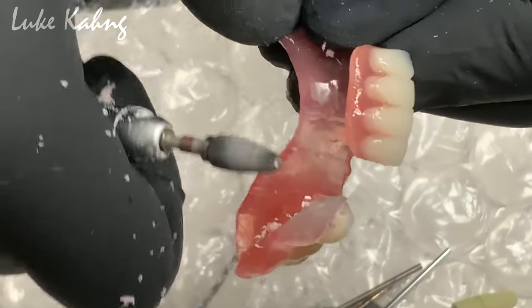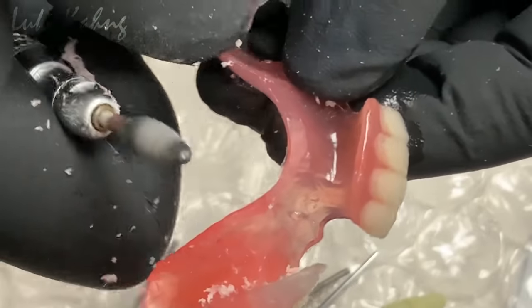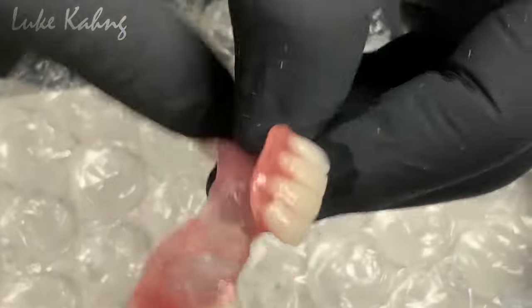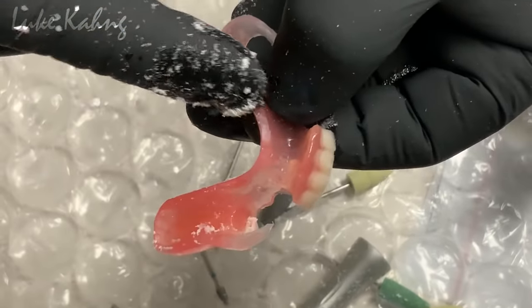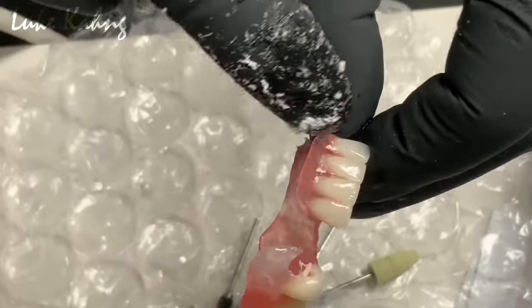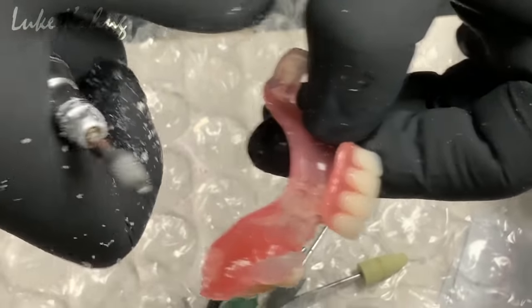See? You just have to keep going in one direction. And that direction is towards you. And it peels it off just ever so gently. See that? I bet you there's a lot of dentists out there that actually go in there with something more rough like this. And they basically end up destroying a flexi partial. It happens a lot. I see these come to my office completely butchered. And I realize that they look like that because the dentist used the wrong one.